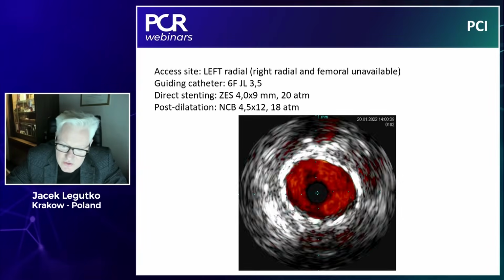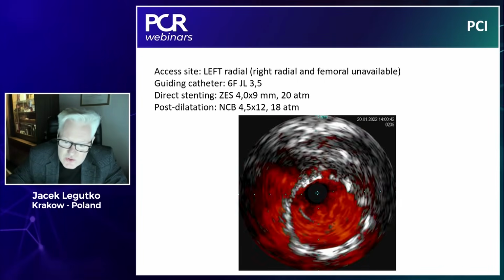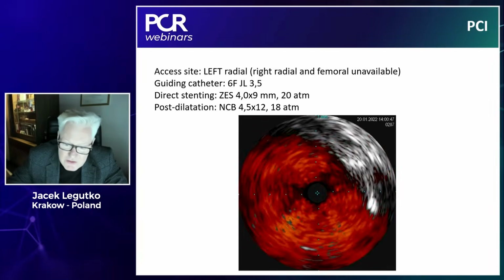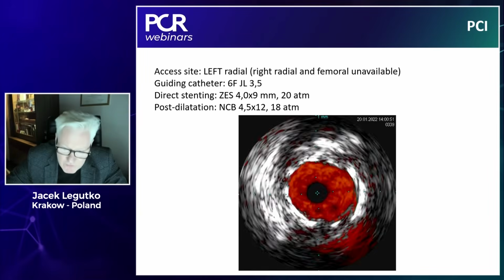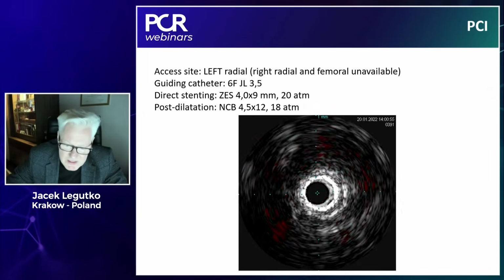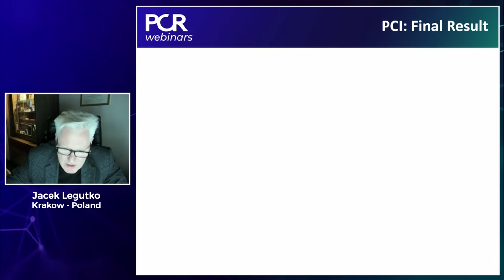And here you see the double layer of stents, and as you can see now, the ostium is fully covered, the stent is well opened. It is protruding, but it was not damaged because I was trying to be very careful with all the maneuvers from the guiding. At the same time, at the end, I dilated with the balloon all the stent which is protruding to the aorta.